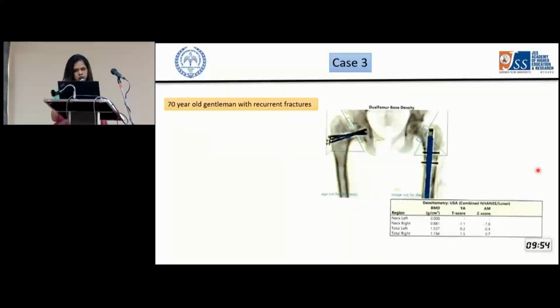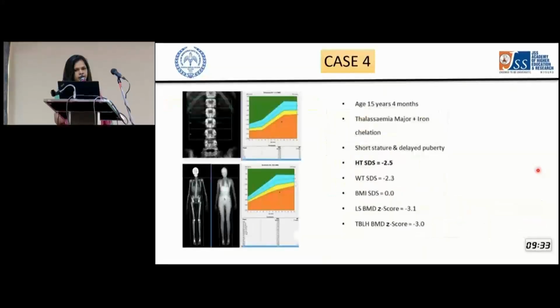And of course, we know this. So many of my friends just call me and tell me that this patient has had multiple fractures. I have a BMD report in front of me. The T-score is 0.2, 1.5 or minus 1.1, and it's very essential to ask them to send the pictures, because many of the times there are prostheses and you are getting a falsely high BMD.